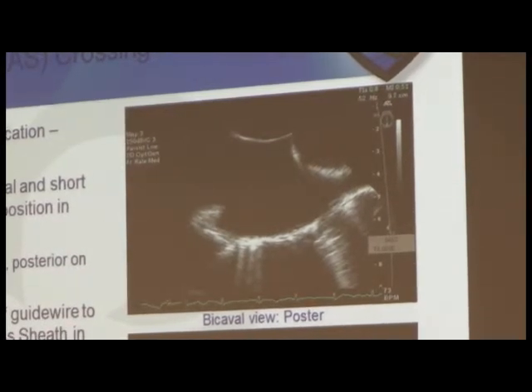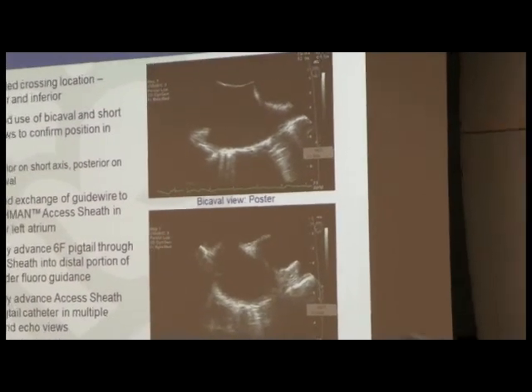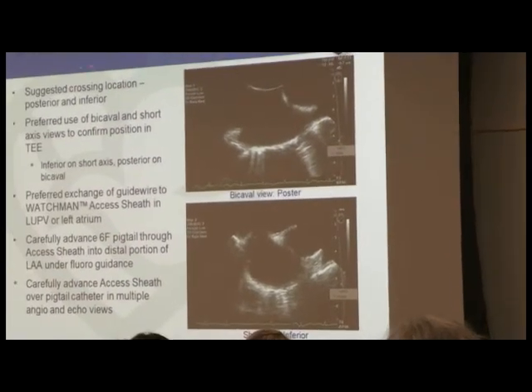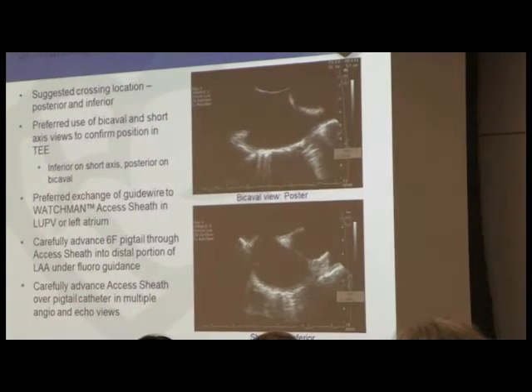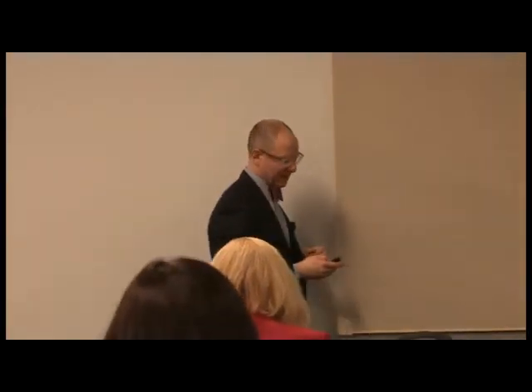So obviously, this is the aorta, so you want to stay away from that. That's not a good place to put your transseptal puncture. And then we want to be inferior as well, because the left atrial appendage tends to be superior to the fossa ovalis, so you want to look up at it. It just makes getting in there a little bit easier. And then there's the ideal place where you want to cross the interatrial septum, but then there's also the reality of just where you can physically do it, which can be dependent sometimes.